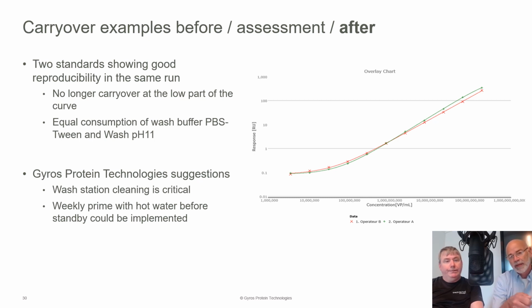So I'll take a Sharpie and mark on the bottle and then check that in my prime, when I'm setting up to do a run for the day, it actually did consume 100 mils of the wash station solution in both solutions. And you can set that in the maintenance of the system. So it's a good way to do a check on whether or not you've got a clean wash station. Yeah, I think that's a really good suggestion.